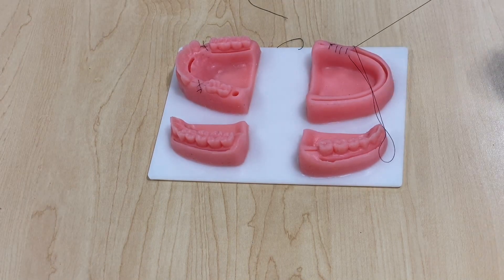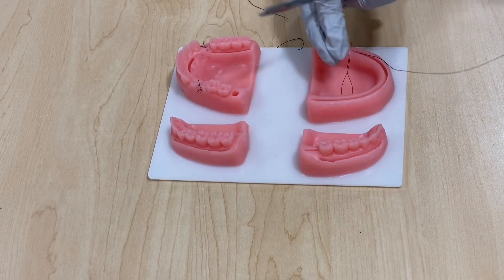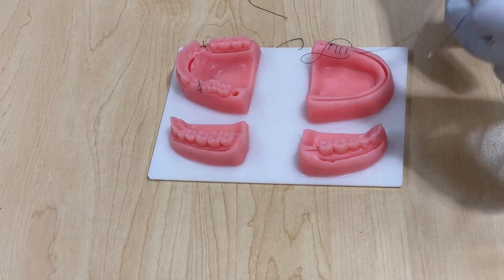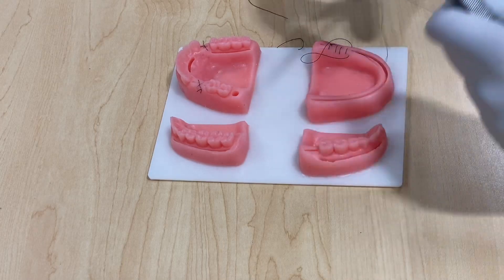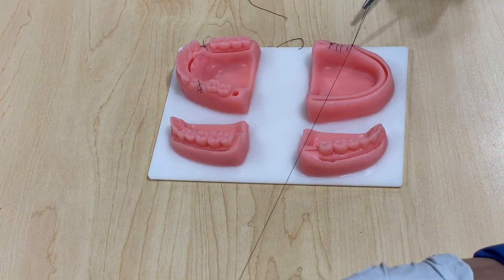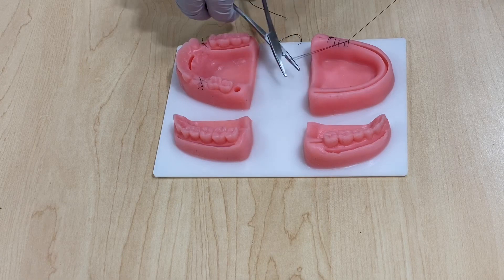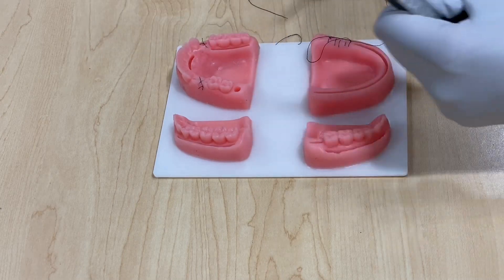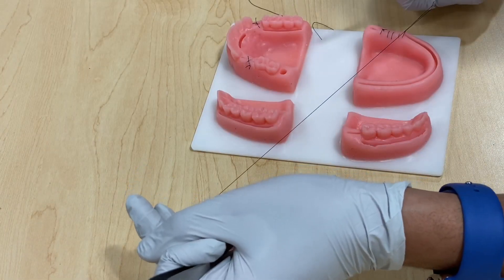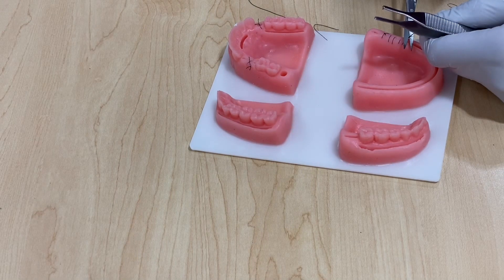Instead of pulling all the way through on the final pass, leave a loop and use it as your short tail. Do two loops toward the short tail, take it and pull all the way. Then do one loop on the other side — it's going to get stuck. And that's it — just cut it.